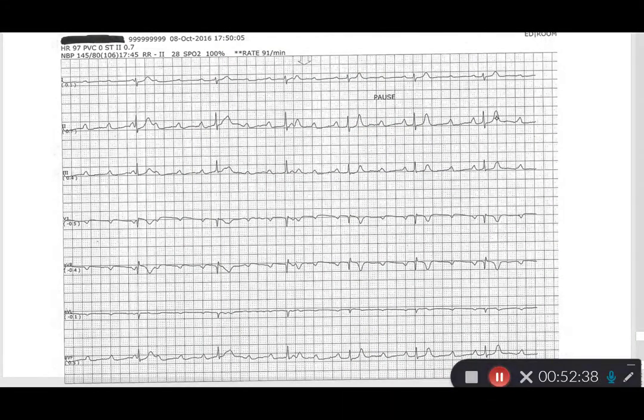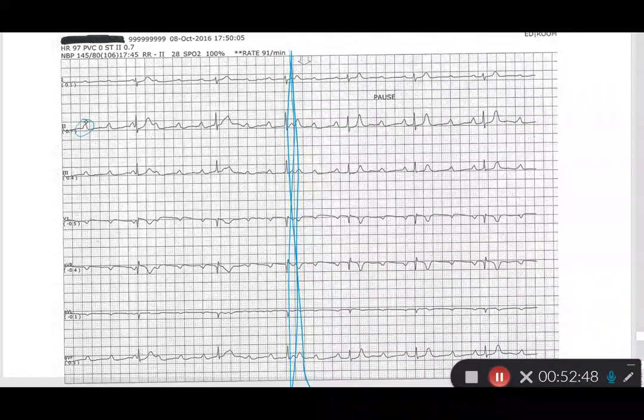Looking at the next section, let's see, where does it split? Right here. So looking at this first part, I have a P wave, P wave, P wave, and this is just 5 seconds later, P wave, P wave, P wave, P wave, P wave. So I have multiple P's per QRS, I have a regular rate, my RR is regular, and there's no relationship there. I have different PR intervals for each one. So she goes into a complete heart block, so third degree heart block.